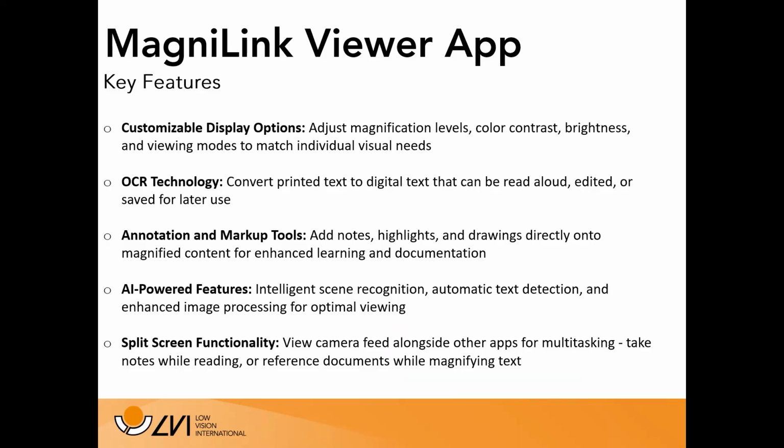As an example of this, we have a student here in Tennessee who is a reluctant assistive technology user. I think some of you may kind of know that experience. And this student was also very, very interested in the movie Wicked. So her TVI actually partnered with her to go into the end user settings and change the color of her icons, the color of some of the words in her interface to that Wicked pink and green. And that encouraged her to actually use her technology.